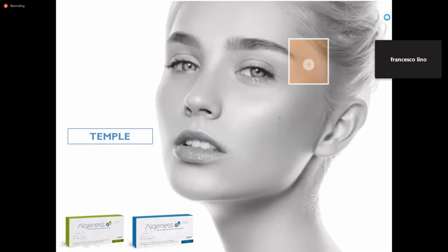Thank you. I am following up my patients for 3 years, and they don't need any operation till now. It creates a space there, and the fibrosis and wound healing just replace the deformity, because the material has a scaffold effect. Actually you are injecting a scaffold there. So in the healing process, you restore something there. Yeah, that's amazing. Thank you.